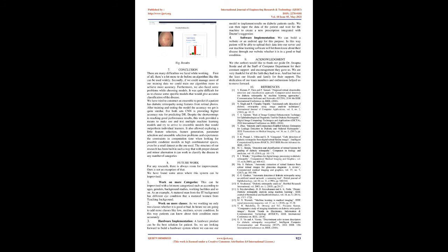from teaching background. 2. Work on more classes, as we are working on only 2 classes, whether it is good or bad. In future we are going to add more classes like low, medium, severe condition. In this way patients can know about their condition more accurately.